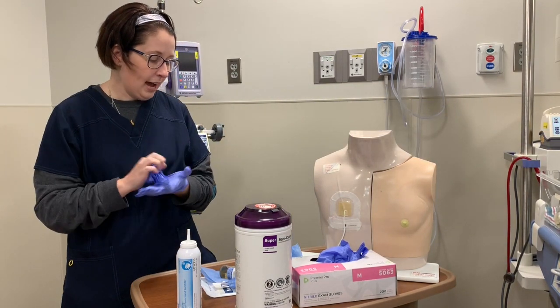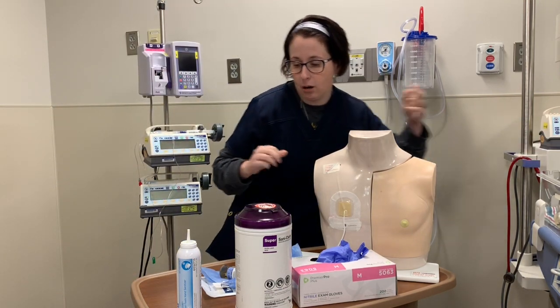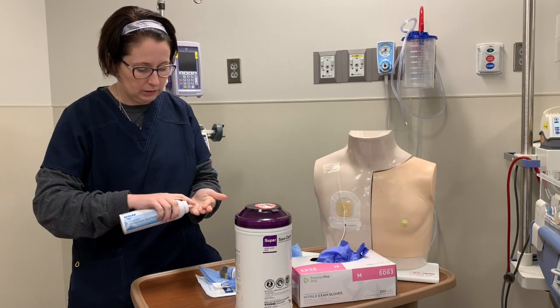After that, I'm going to take off these gloves, wash my hands, and get a new set of gloves so that I can prepare my sterile field and supplies.